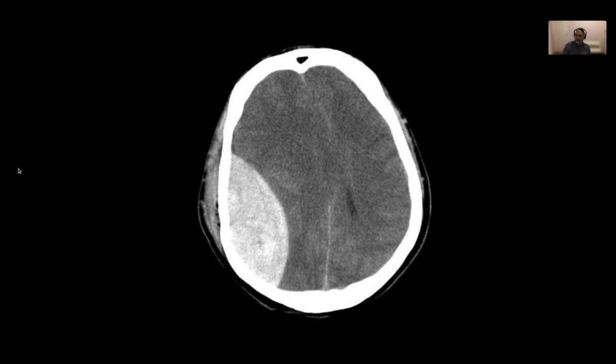This is not subdural. Subdural does look like a banana, actually. This is the lemon. It's something dural. So what's the other? It's extradural. Correct. So absolutely. You see some bleeding on the outside also. So if you have a trauma and if a meningeal artery ruptures, then the bleeding is outside the dura. And so it looks like a lemon or a football or, you know, a rugby ball. And that's an extradural hemorrhage.